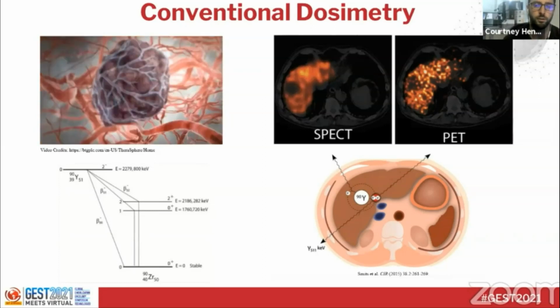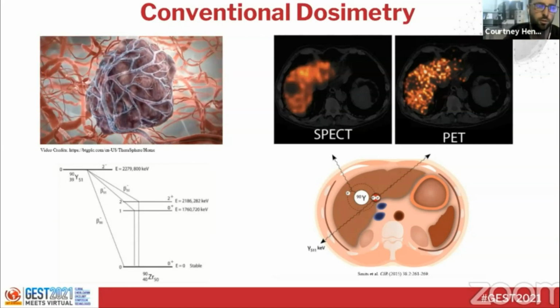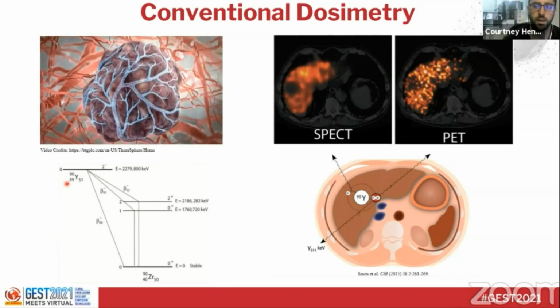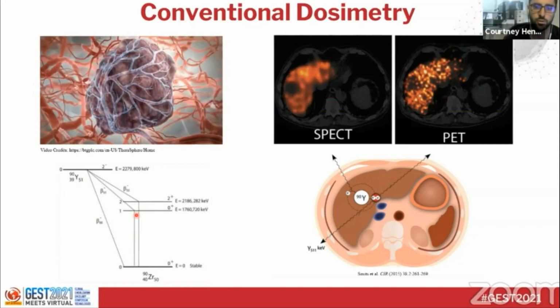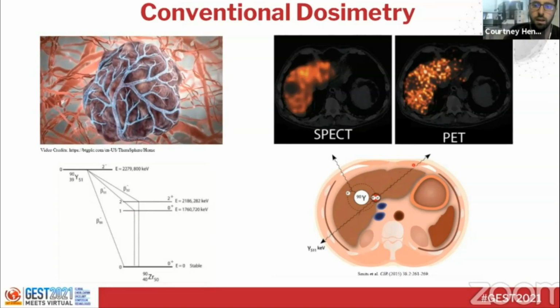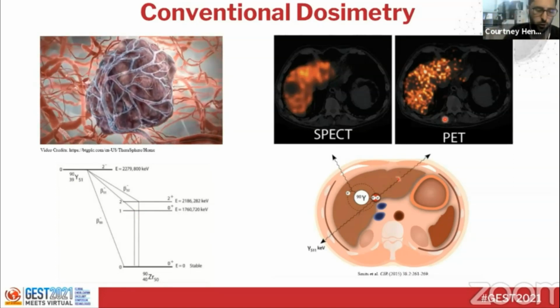To begin, radioembolization is a well-established treatment for inoperable liver cancer where radioactive microspheres are administered into the hepatic arterial blood supply to embolize the tumor's microvasculature and deliver tumoricidal doses of radiation. Glass microspheres are infused with Y-90, which decays through the emission of high-energy electrons and, less often, high-energy positrons. Between the Bremsstrahlung and coincident photons produced in this decay, we can perform both SPECT and PET imaging to provide estimates of the absorbed dose in radioembolization.